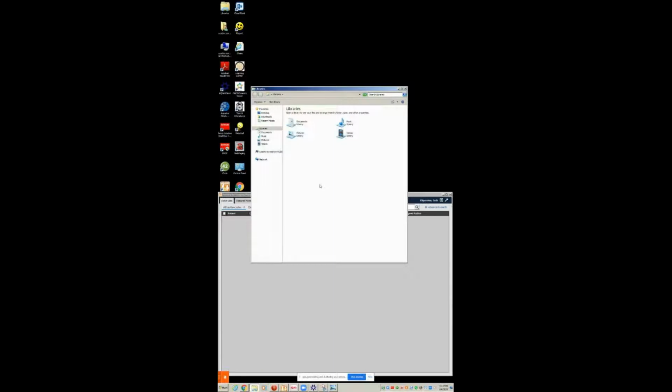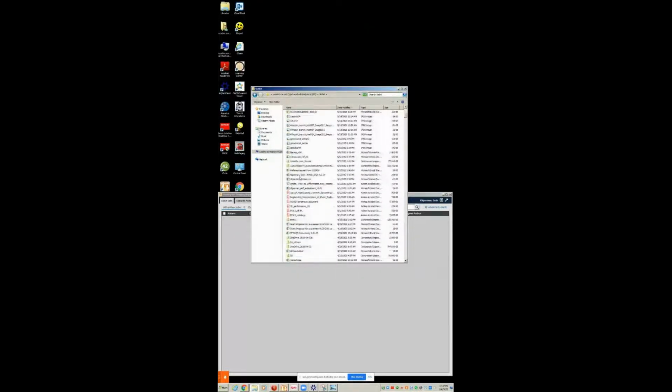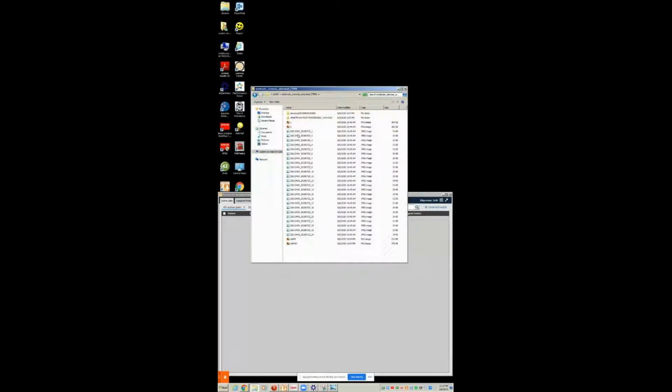So, Seth, naive question: what does FFR stand for? Fractional Flow Reserve. The concept comes from cath, and it's basically a percentage of the pressure differential proximal and distal to a stenosis.